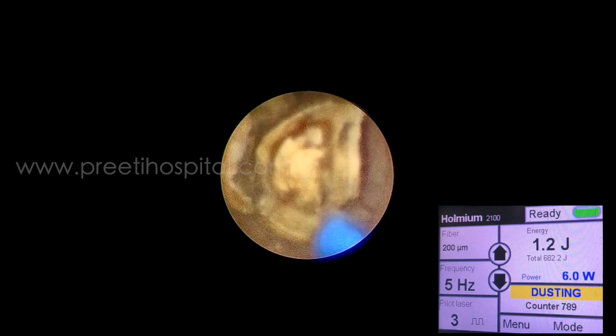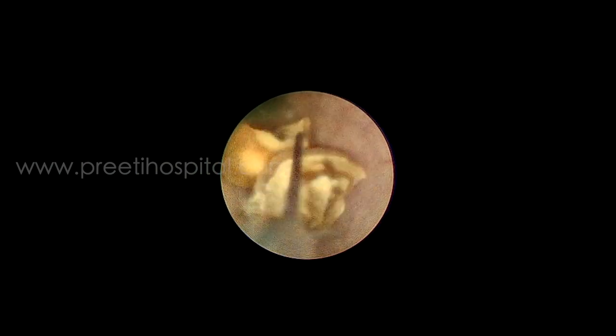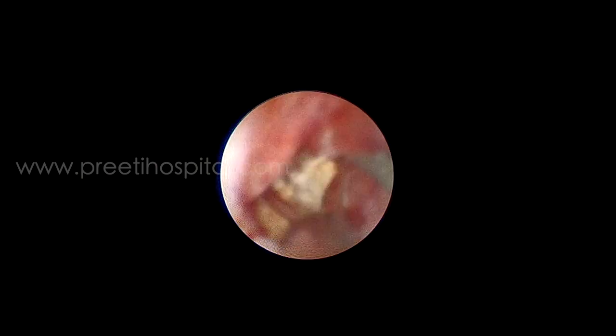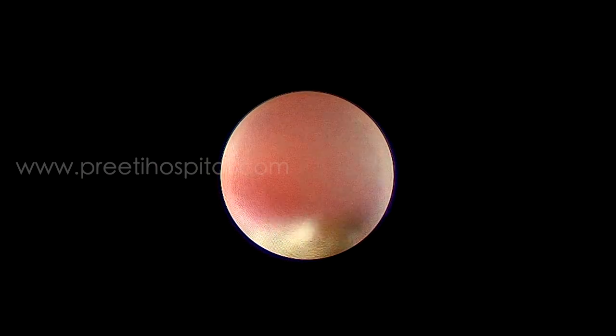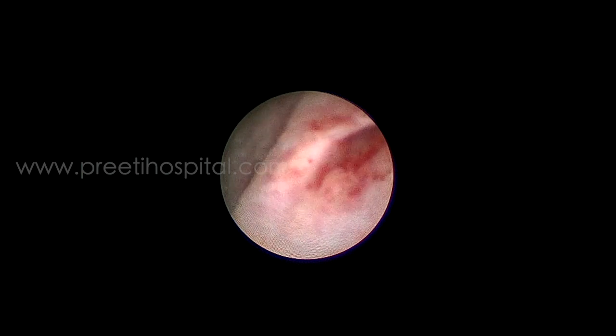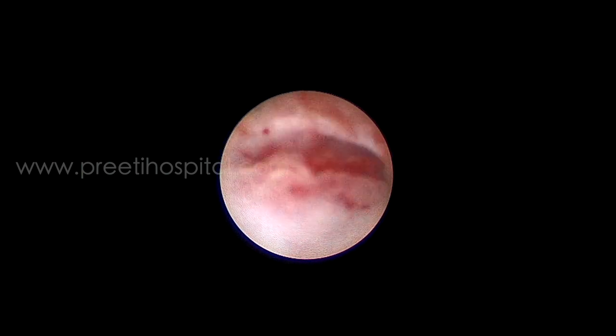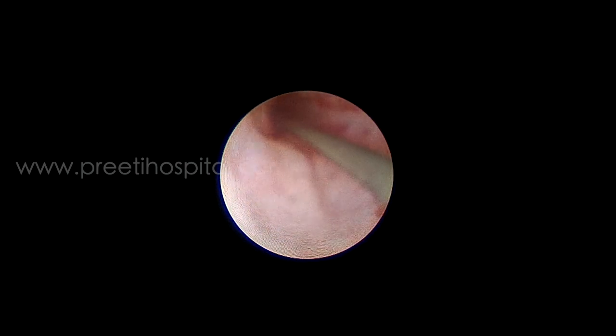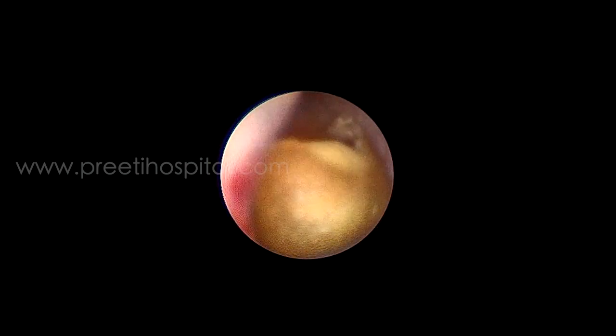Once a fragment small enough to be retrieved through the ureter is made, it is retrieved gently by rotating using a triprong forceps and left inside the bladder. To re-enter the ureteric orifice, the scope is rotated anti-clockwise for the left ureter and clockwise for the right ureter for atraumatic entry into the orifice.